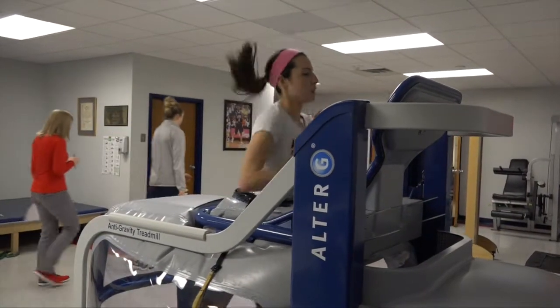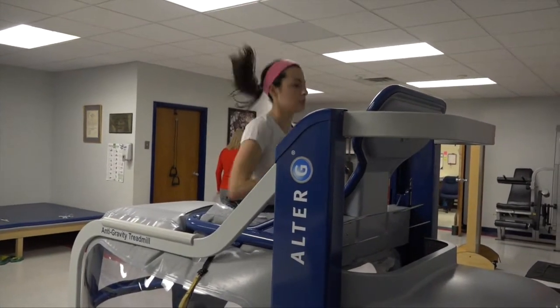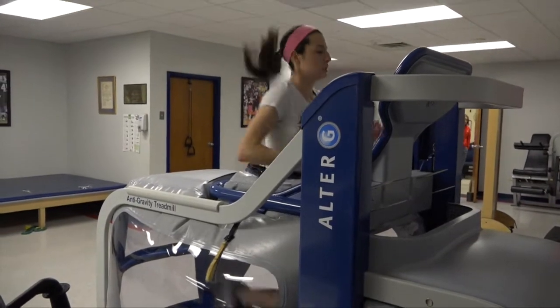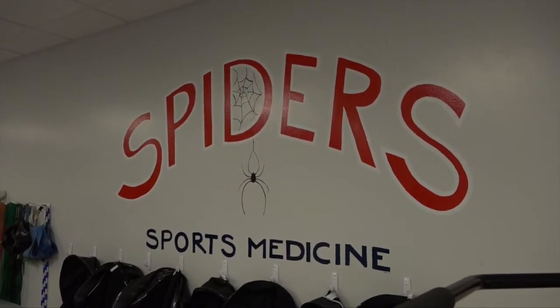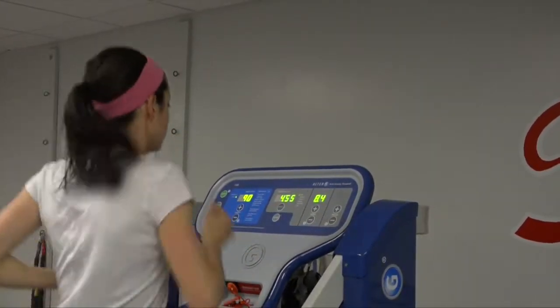The Alter-G has been extremely beneficial for the majority of our team throughout the year, and Amanda is one of our best examples of somebody that was able to come back from injury a whole lot quicker than she would have otherwise. For most injuries in the past, we've had to be very cautious coming back — taking it slowly, day by day, drawn out over weeks to the point where it takes three or four weeks before they're even running 20 minutes at a time, because we have to be so careful running on land at full body weight.